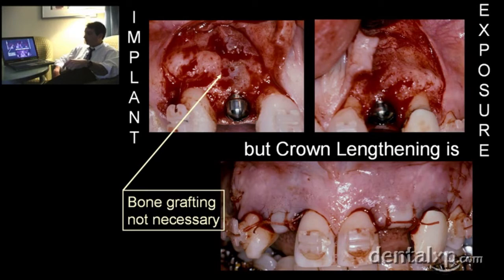And one of the things that I frequently see with dental implant placement, especially in the lateral incisor area, because you have that little concavity in the canine fossa, is that it looks like you don't have the root prominence. One of the ways that we get around this is by overbuilding the bone. In this case, we had a lot of bone because the canine was there on the upper right, and on the left side, we just happen to have a lot of bone for this area.